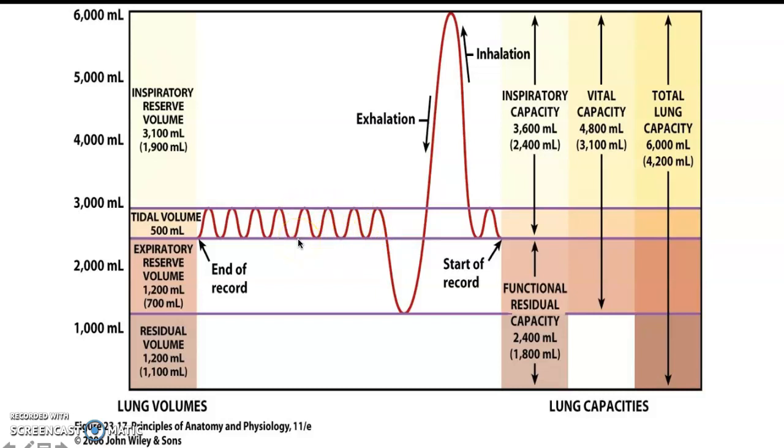So we're actually going to start with this very quiet breathing here. This pattern, this very regular in and out that you see. The volume actually fluctuates between a pretty stable maximum and minimum that are not too far apart. We see this very regular in and out, and we call this volume here the volume of air that moves in and out during this passive, quiet, normal, at-rest breathing. We call this the tidal volume, and I always think of this as the tide goes in and out, the air goes in and out this way in a very regular, repeatable way.